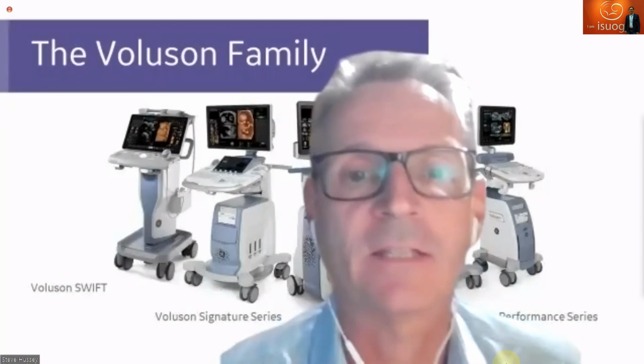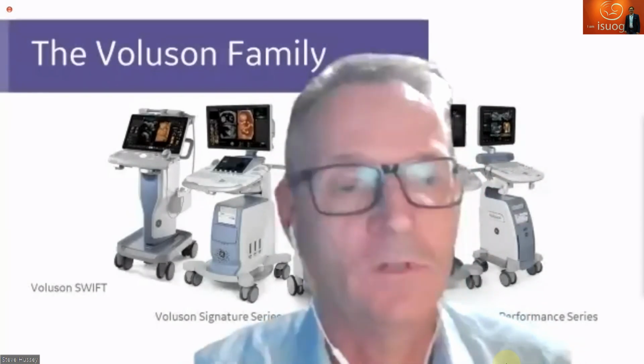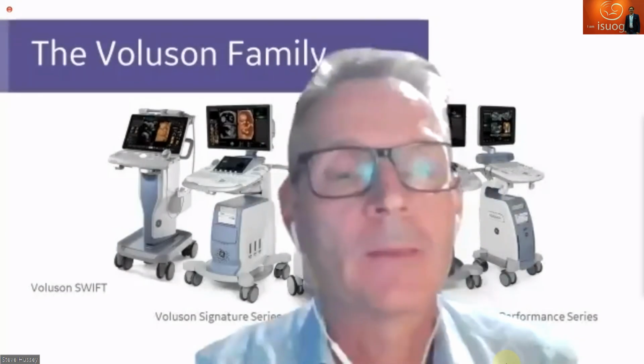Okay, excellent. And the last question I think we'll take is about VSDs. When do you consider a VSD significant? What sort of size would you consider significant? Well, this is a good question. I will not say the size of the VSD, but I will use the position. The muscular VSDs are rarely of any importance. Almost all will close, or even if you see it on 2D, it's maybe not important.